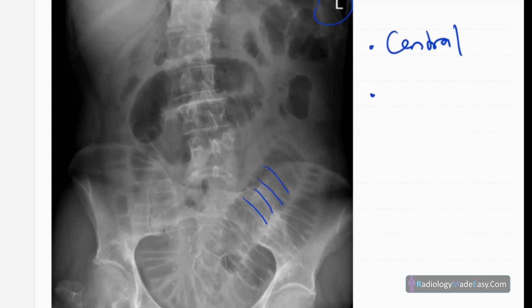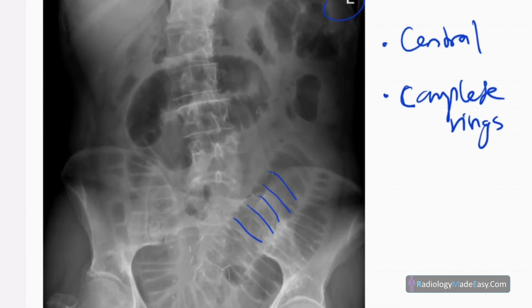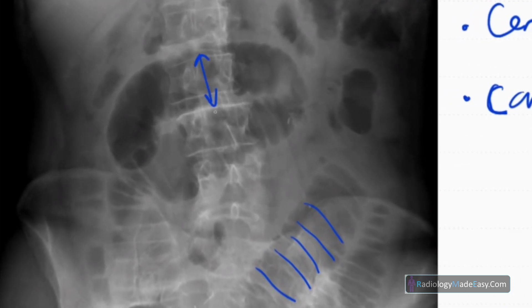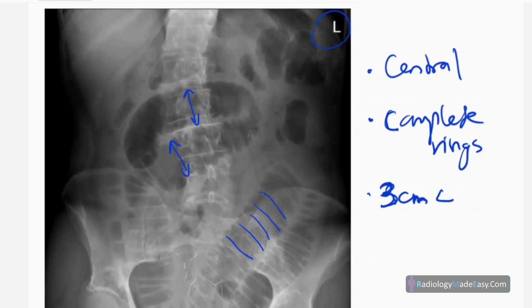The complete rings are called valvulae conniventes in the small bowel. These bowel loops are dilated, usually more than three centimeters. You cannot see any peripheral dilated bowel loops in this region.